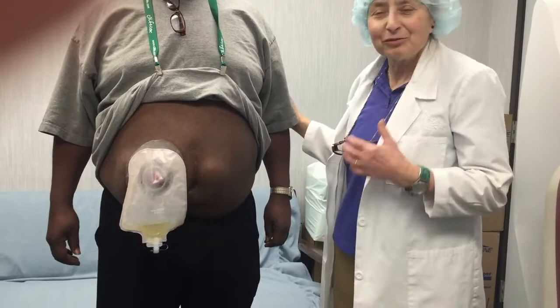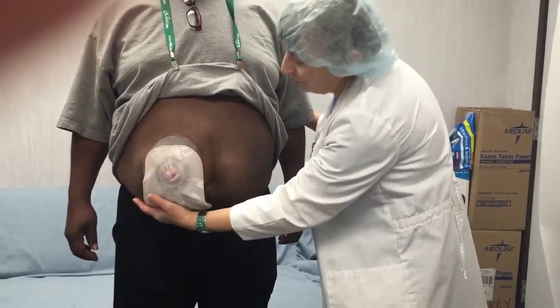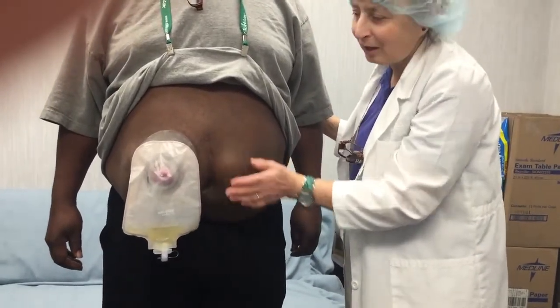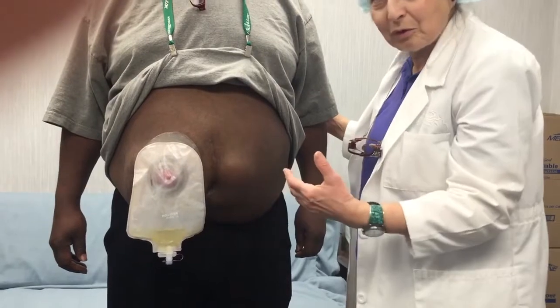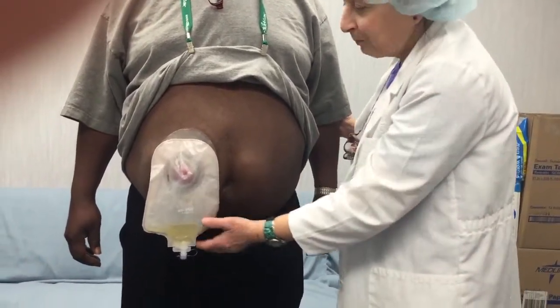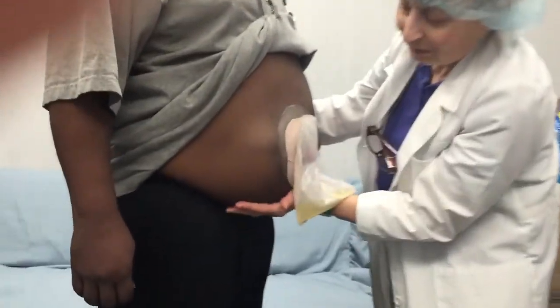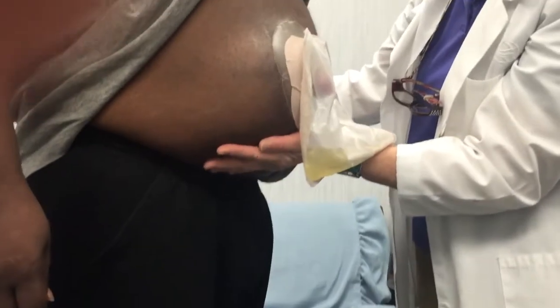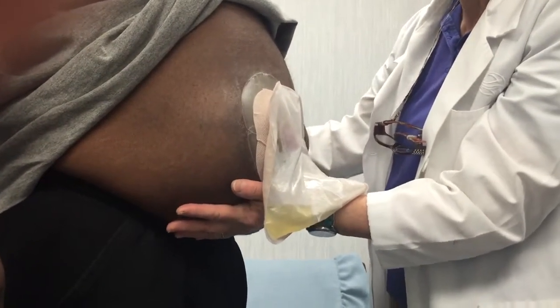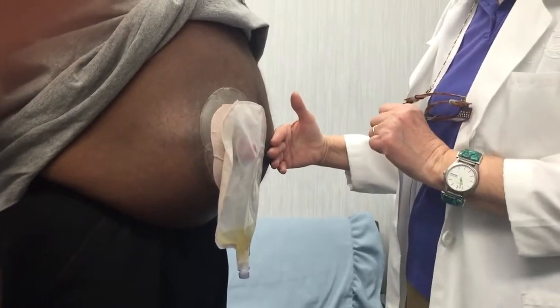Here we have this gentleman, and he has not only one hernia, which is a good size, he also has another hernia on the other side. What we're going to want to do is support this hernia — and if you turn toward me a little bit, you can see we're going to need to be able to cup and uplift and support this type of hernia here, and also be able to support the hernia on the other side.